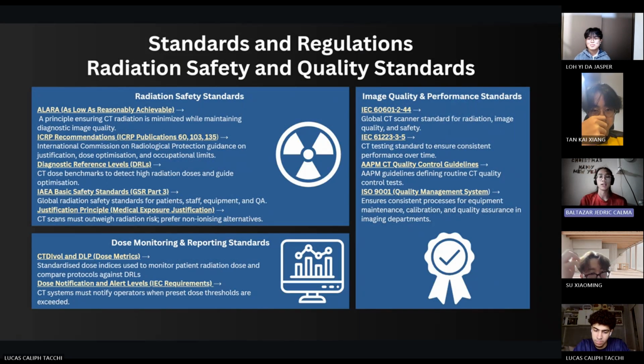Finally, radiation safety and quality standards protect patients and staff. The ALARA principle requires radiation doses to be kept as low as reasonably achievable. International organizations such as the ICRP and IAEA provide guidance on dose optimization and justification of CT scans.